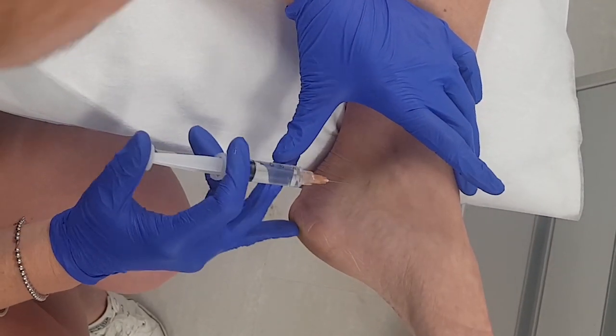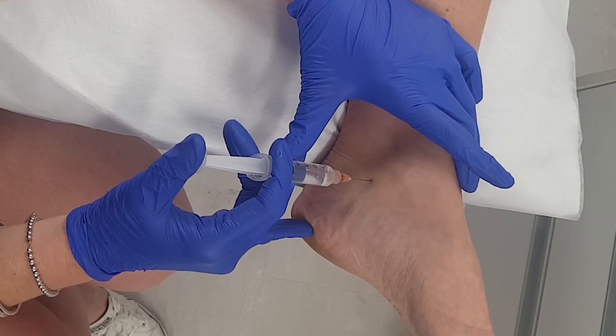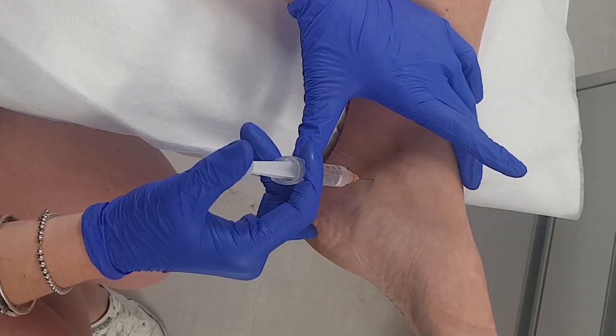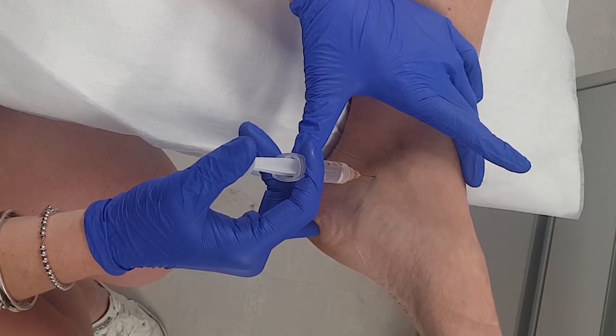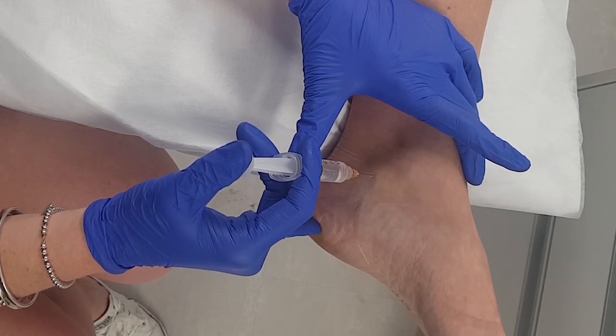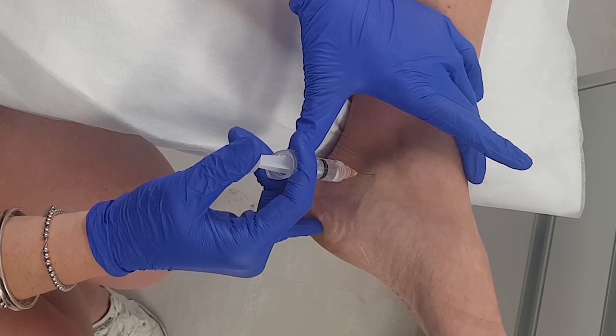We're going to go straight into that mark, just through the skin only, inject some local anaesthetic, and very slowly advance — really slowly, while you're injecting. Tingles! You're tingling already — stop and dump the whole lot. It burns! Yep, that's it. So once you get that burning tingling, you're done.